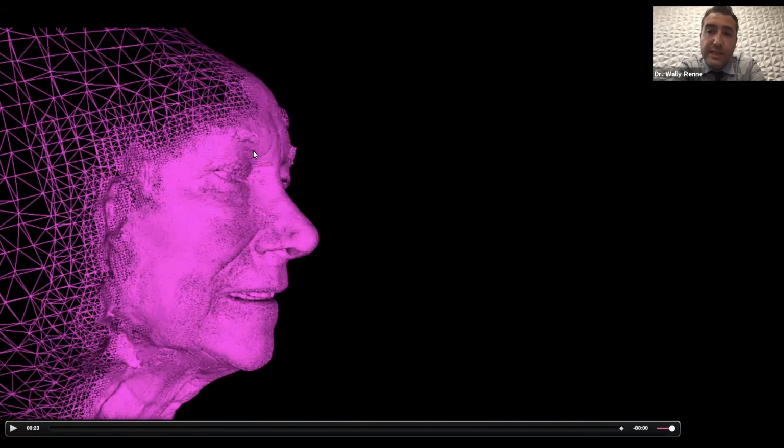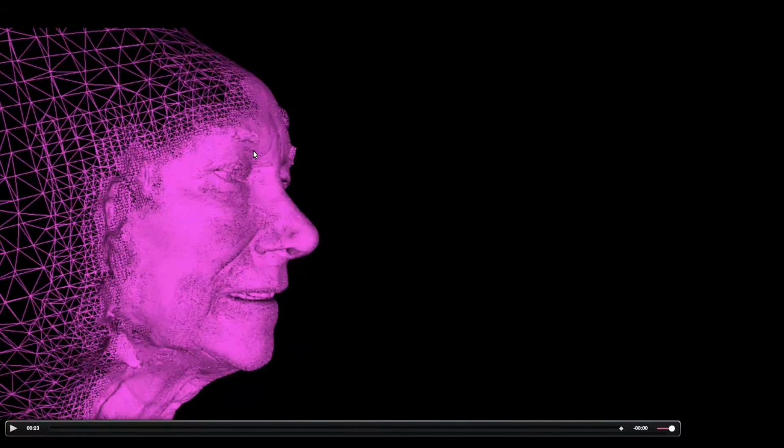On average, it's 6 to 8 millimeters from repose to full smile. So there's a lot of things that we need to take into consideration with that. That's a good question. Perfect. All right. And then next question, any gingival contouring or gingivectomy required?